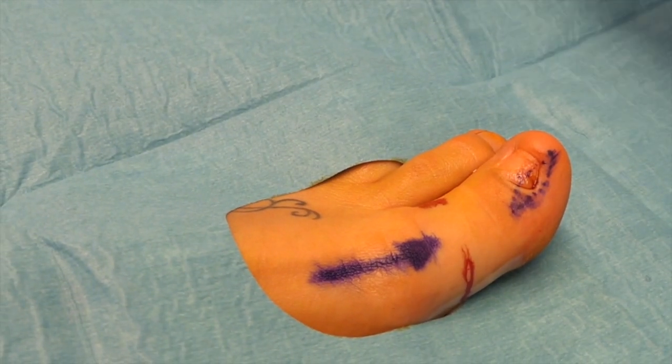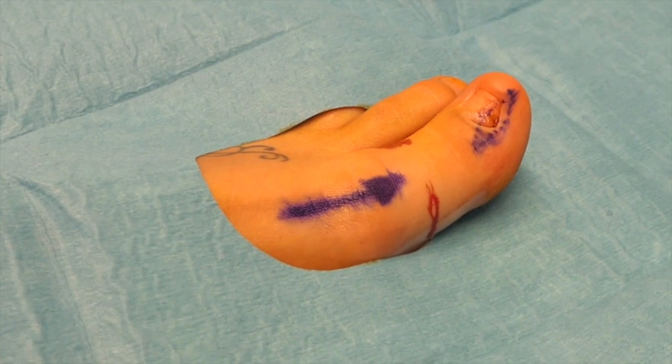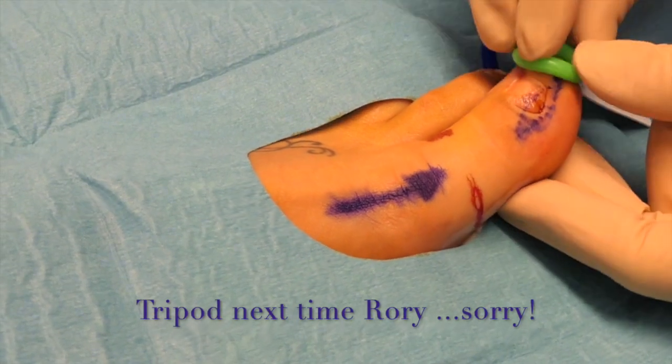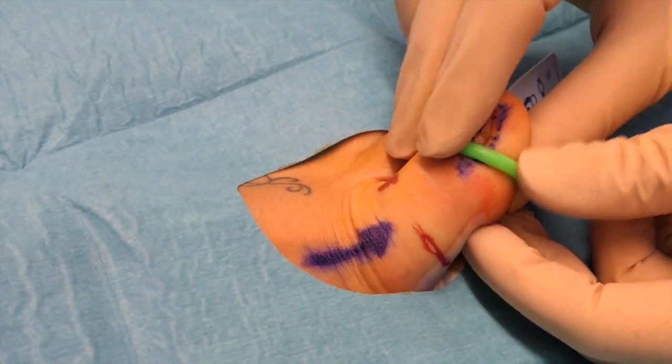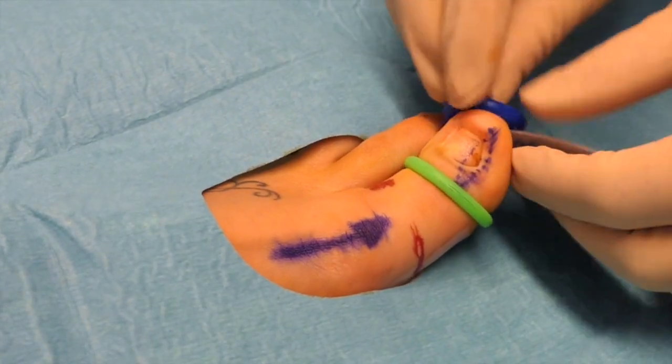Do it with a digital tourniquet, different types of tourniquets. Tourniquet time going on at 8:41. 8:41. What's that in English, Monica? 8:41? Trying to see. No, I'm good.